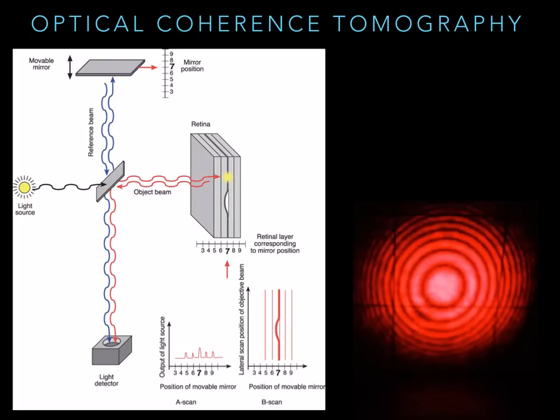I'm already giving you more than you need to know. If you say Michelson interferometry, you basically have the principle of OCT. So nobody's going to make you explain this in a mock oral setting or regular oral setting as far as I know. Let me see if I'm forgetting to say anything else here.